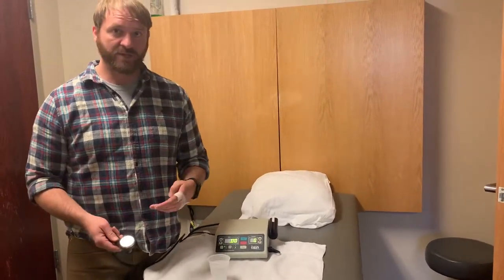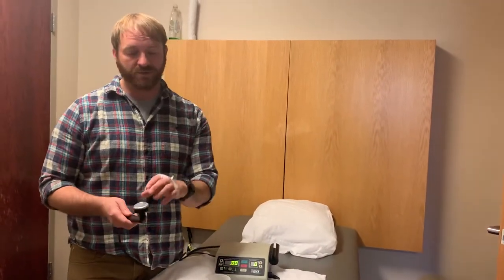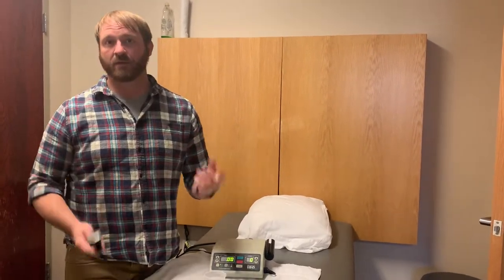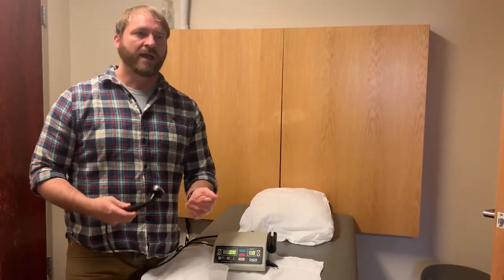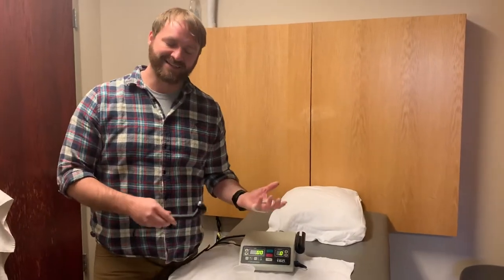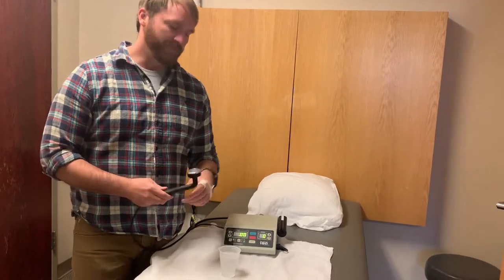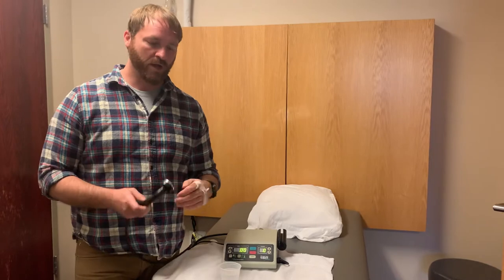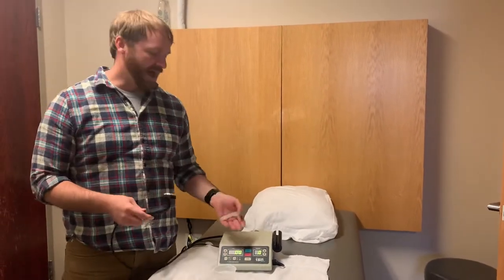The other thing that you can use is you can also do this before or after a whirlpool treatment. You can use the ultrasound head underwater, using the water as a conducting agent rather than a gel or lotion. They do however recommend that if you are doing it underwater, you increase the intensity by about half a point.